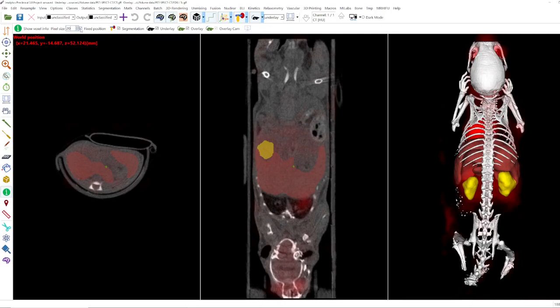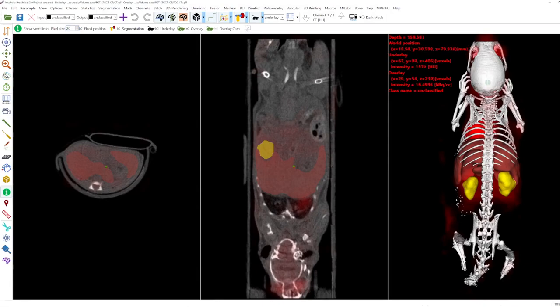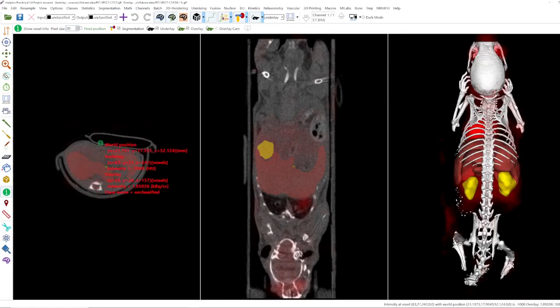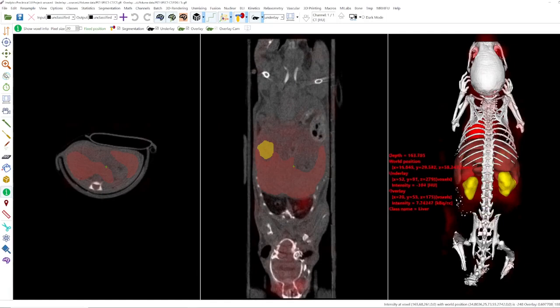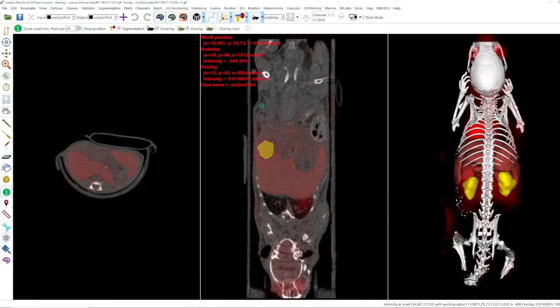Then we have 'Fixed Position'. If this is activated, the information will always appear in the left corner — in the axis view, the corner view, and also in 3D. When I deactivate it, the information will appear where your mouse cursor is, so you directly see the information where you are, both in 2D and in 3D. I'll activate it again because for me it's better to have it in the left corner so you can see your whole image, segmentation, and everything.